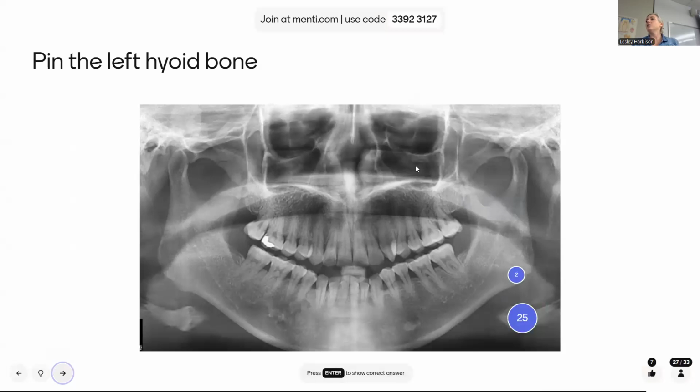Yeah, so we have the nasopharyngeal and then the oropharyngeal as we come down. And see how they branch together? They connect. So the nasopharyngeal is up here. You can just see that shadowiness. You have to kind of look in layers, right? You've got to look through things sometimes to find other things. But if you just look for the darker areas, we have the nasopharyngeal through here and it connects to the oropharyngeal.